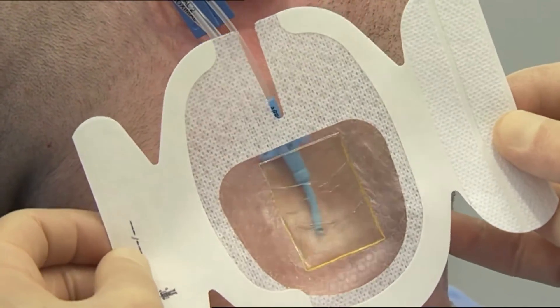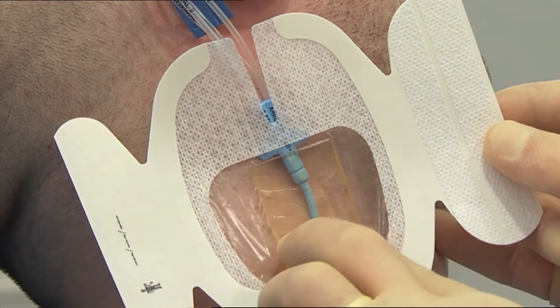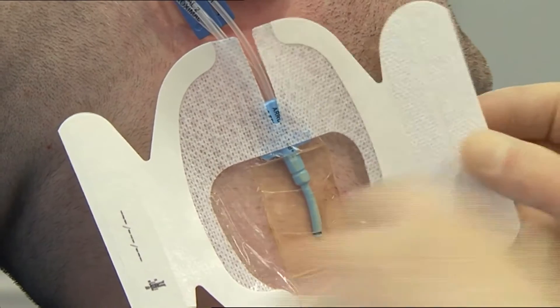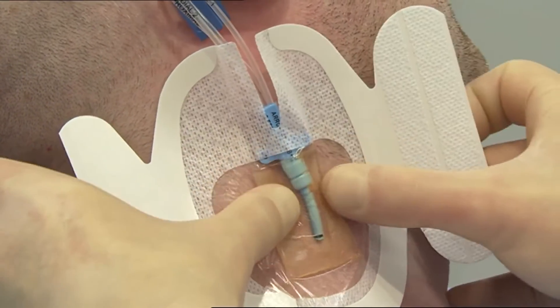Centre the CHG gel pad over the catheter site and smooth down the centre of the dressing. On sutured catheters, the gel pad can be placed over both insertion and suture sites.